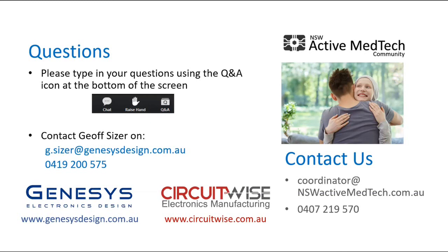So in terms of what's done along the way, it's fairly normal to do pre-clinical evaluation work as a part of requirements to capture the requirements for the device. It needs to be done, as I said, with ethics committee approval. You can't just willy-nilly start testing devices on unknown suspects. But nevertheless, it is a relatively informal process. It is important to determine whether you're going to rely on outputs from that process purely as knowledge gathering, or if you are going to try and use that information as part of your final clinical submission.